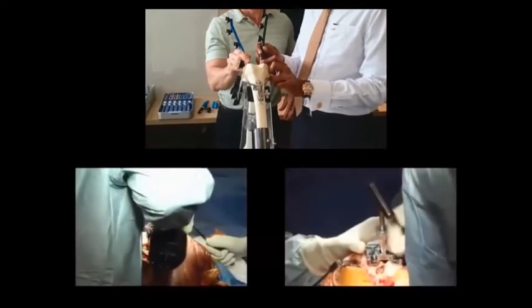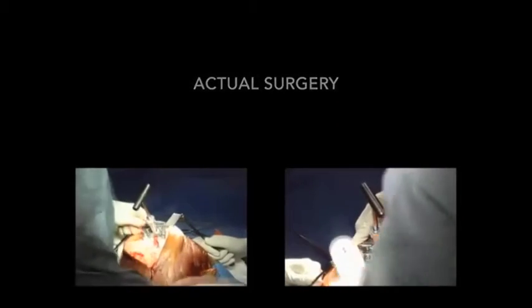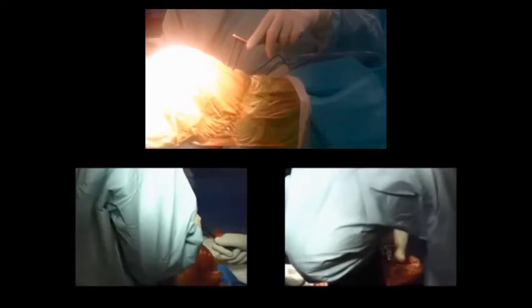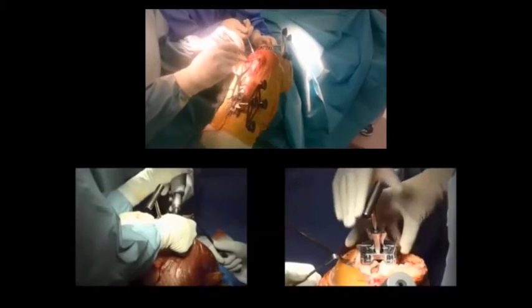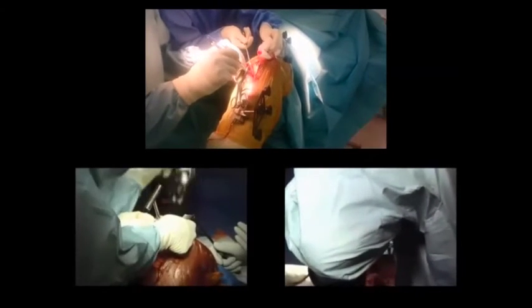Here is where we will position the implants in place in the virtual space. The actual surgery spends a lot of time registering the implant onto the computer. Here you will see us putting in the reflective trackers into the patient; these reflect off an infrared point light source, and because of this reflection the computer will know where the femur and tibia are. We haven't yet begun the actual instrumentation for the knee replacement — I've only just begun to do an arthrotomy on the Makoplasty panel above.